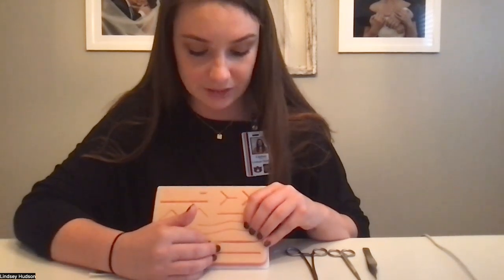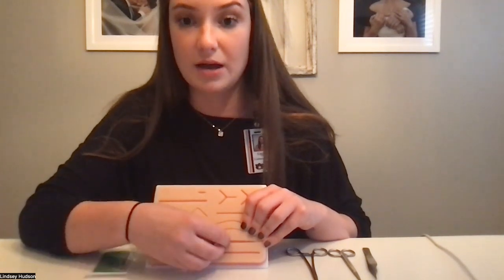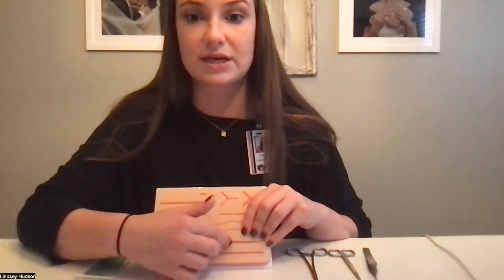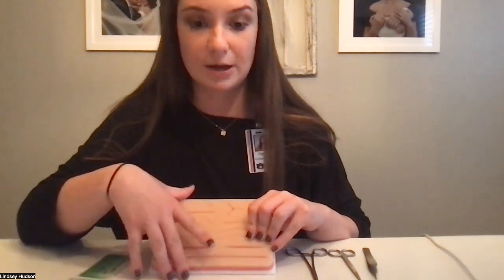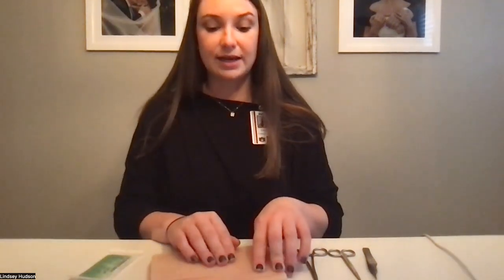A way to know that the lidocaine is actually being injected into the subcutaneous tissue is that the tissue is typically going to turn white and kind of swell up just a little bit. You can do this as many times as you need to ensure that your patient is getting properly numbed so that you can do the sutures. And before you start any sutures, you'd obviously want to test the area, make sure that it's nice and numb. So we have injected our 1% lidocaine and we're waiting on the patient to get numb.